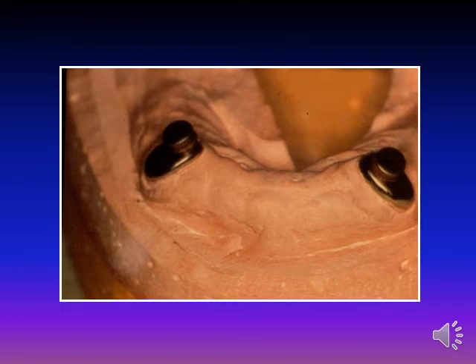There are many advantages for magnets, which include ease of cleaning, ease of placement for the dentist and patient, automatic reseating, decrease in horizontal stress transmission, and retention that is not reduced with use. Magnets have poor corrosion resistance when exposed to oral fluid and therefore require encapsulation with an inert alloy such as stainless steel or titanium.